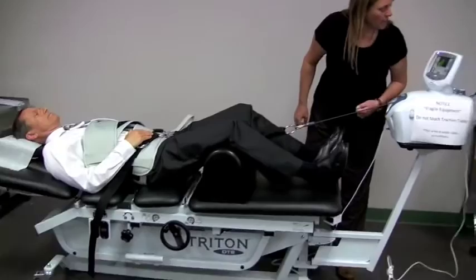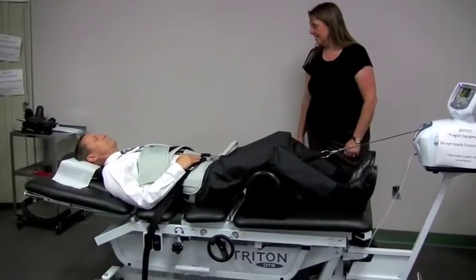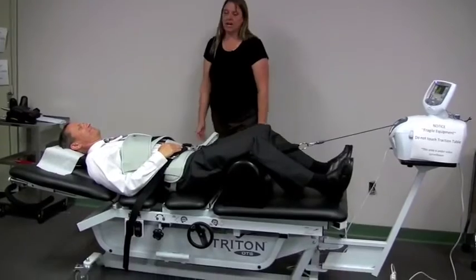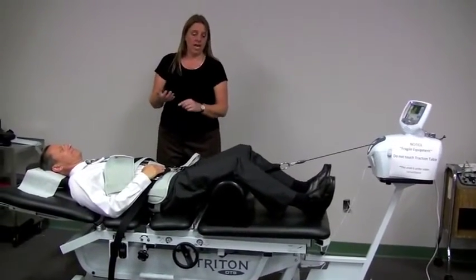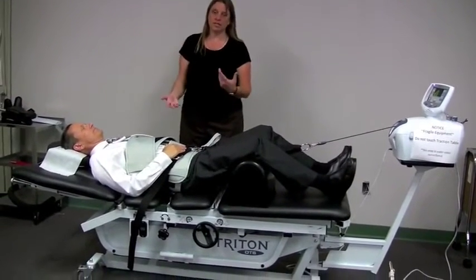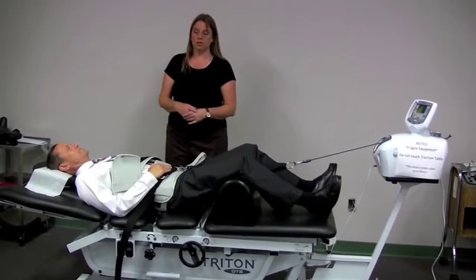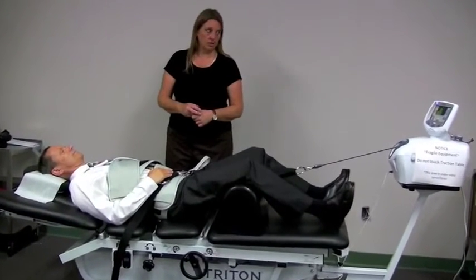We're down to 38 pounds. You're in the middle of an intermittent phase. How do you like it? Good. Now, the important things about this is if any of this had caused any increased discomfort, or if he was a patient who had some radicular symptoms, you had perhaps a disc involvement, you don't want to do this if it hurts them. There should be no peripheralization of the pain during this procedure.